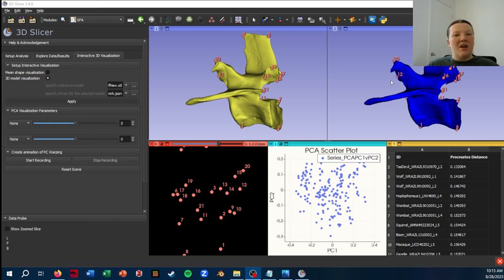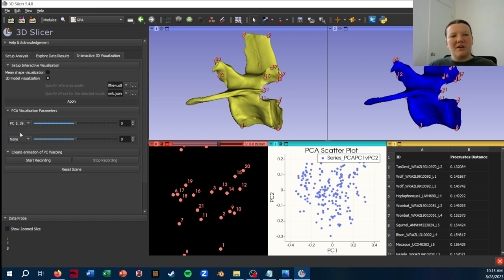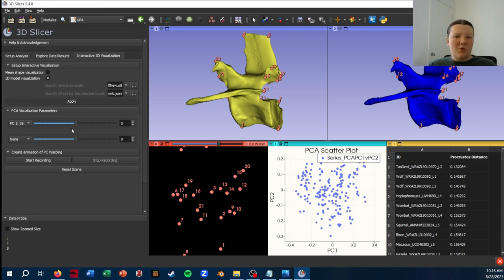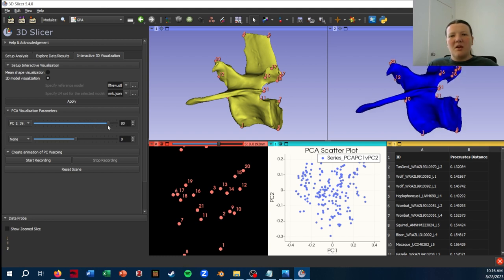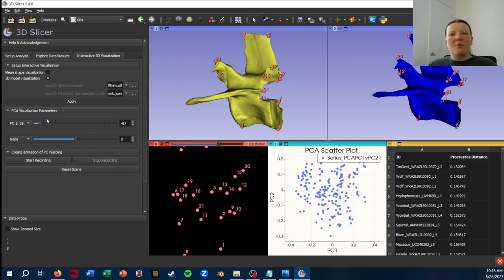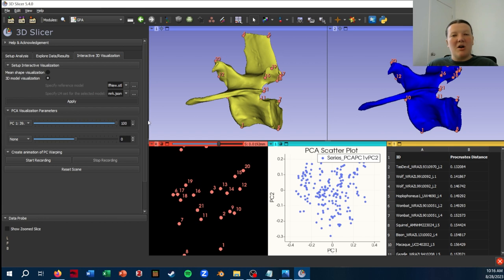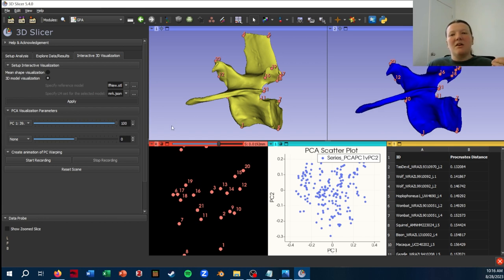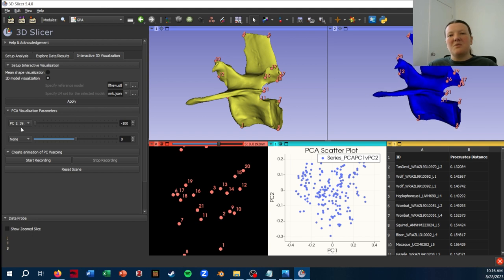So the right side is where we're actually going to be able to visualize how the shape changes along different axes of your morphospace. And that is under this PCA Visualization Parameters. I'm just going to select the first PC, PC1, since that's where the most variance is. And then you'll see the slider that I can just drag back and forth. And as I do that, the beaver vertebrae that I loaded in warps to wherever the landmarks are positioned at that particular point along the axis of PC1.